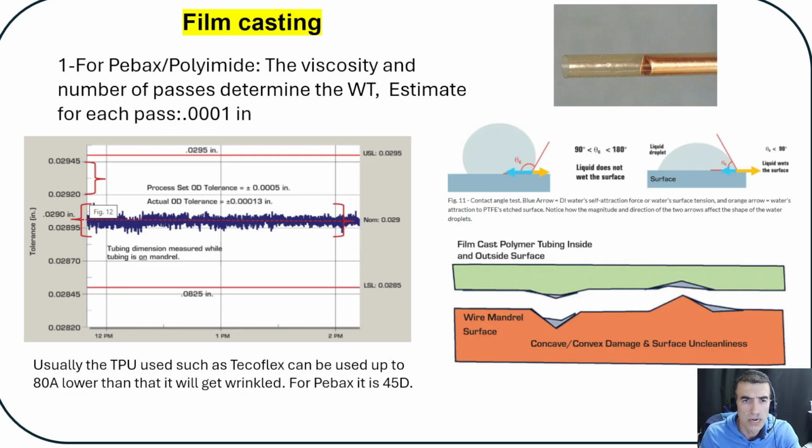The other important thing is the mechanical properties of a film cast, and how mechanical properties would be driven by your process.